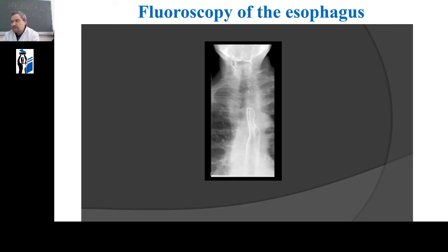Speaking of radioscopy, which is often associated with the past of radiology, for a very long time there was no endoscopic technique at the disposal of diagnosticians, and all studies of the stomach and intestines were based on the fact that the patient took a contrast agent and the radiologist observed its movement through the digestive tube.